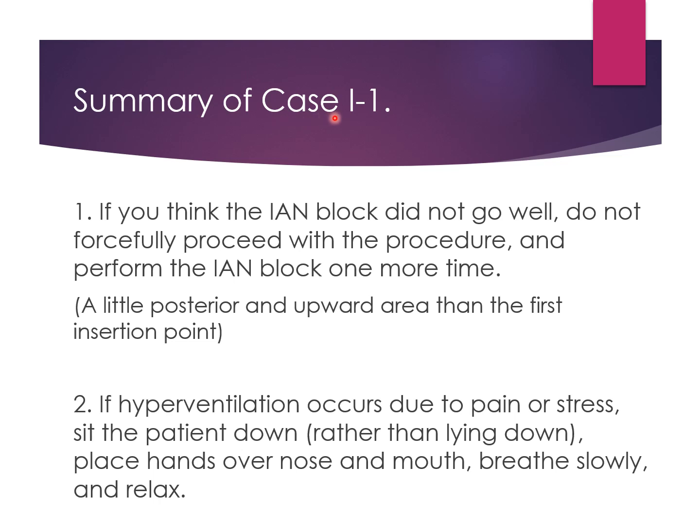Summary of the first case. First, if you think the IAN block did not go well, do not forcefully proceed with the procedure; perform the IAN block once more, in a little more posterior and upward area than the first insertion point.